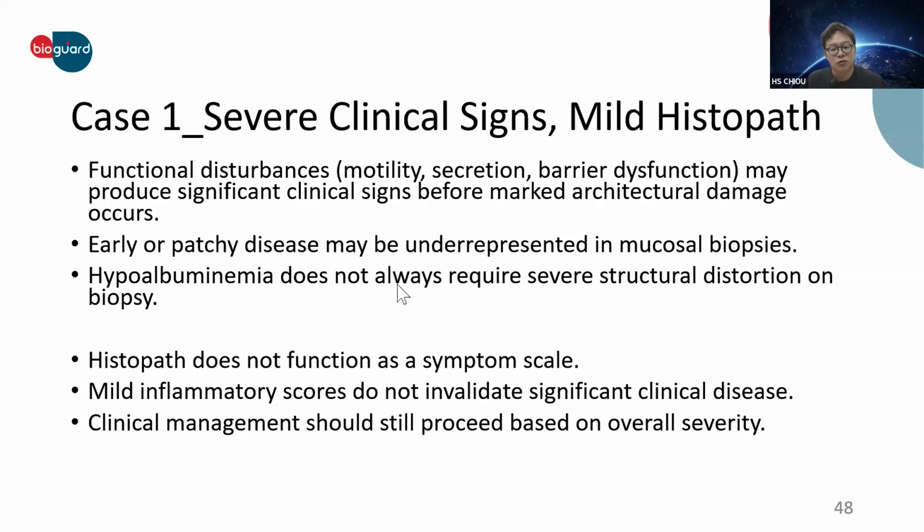This case reinforces an important principle. Histopath doesn't function as a symptom scale. A mild inflammatory score doesn't invalidate significant clinical disease. Management decisions should still be based on the overall clinical severity, not solely on the histopath grade. In other words, the microscope reflects tissue injury. It doesn't measure how sick the patient feels.